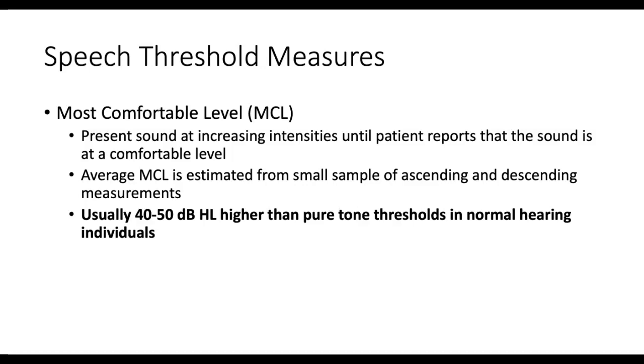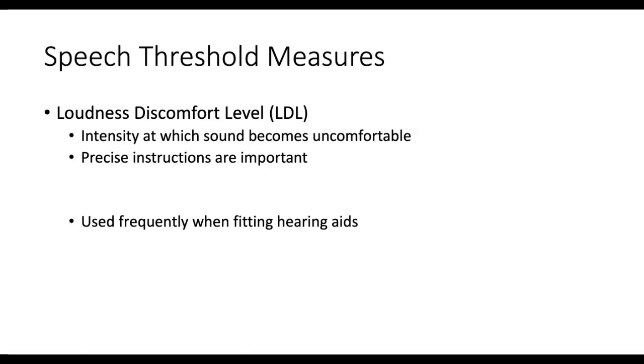Okay, so we also use the MCL when we are working with hearing aids to establish a most comfortable level, and then also an uncomfortable level, which we'll talk about now. So the loudness discomfort level, or LDL, sometimes you'll hear it referred to as UCL, or uncomfortable level. LDL or UCL are the two terms. We use this a lot when we're fitting hearing aids.